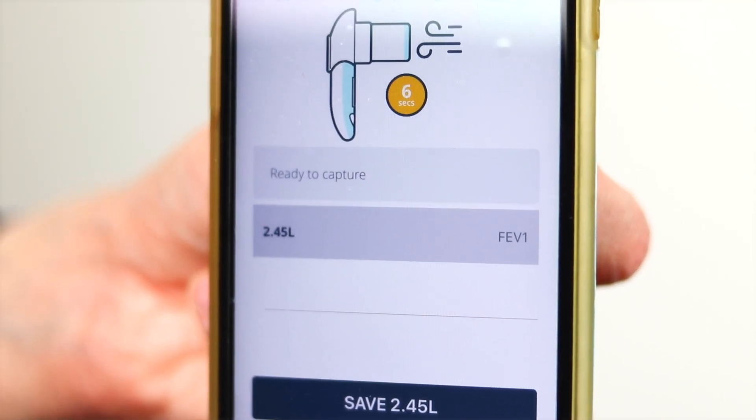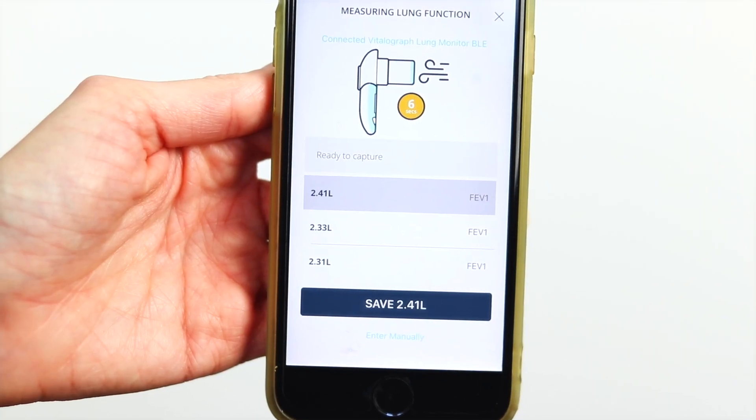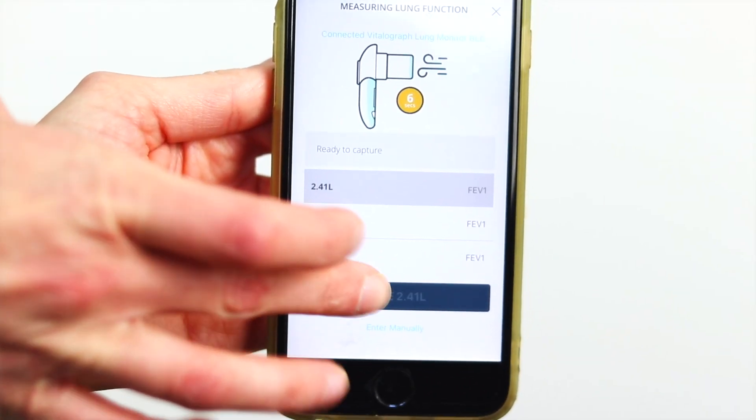When you record a good blow, the FEV1 number will appear in your app. If it is a poor blow, the app will tell you this too. Like in clinic, it's always best to try at least three blows and record the best one. The app will automatically choose the highest blow for you to save, and when you are happy press the Save button.